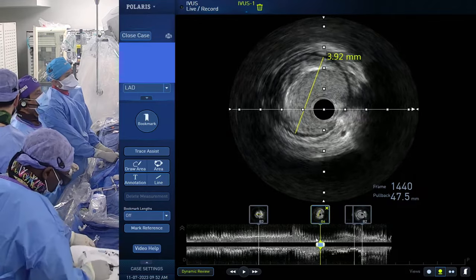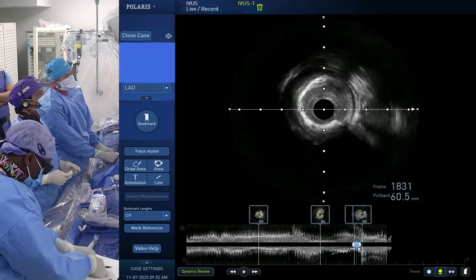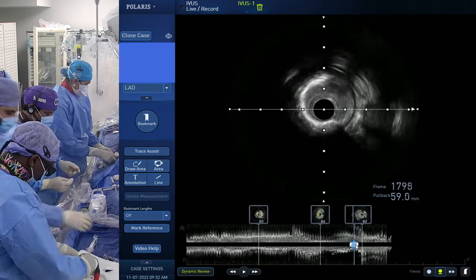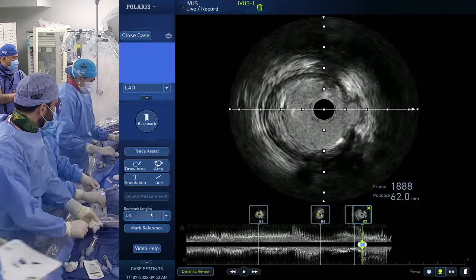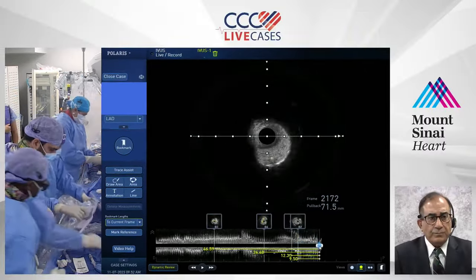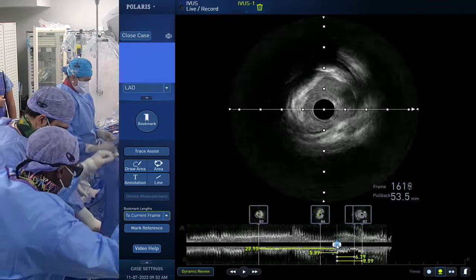Okay, 3.9 is the EEM to EEM, and a diffuse plaque. Go back. You have three quadrant calcium. Yeah, here, three quadrant calcium. This is the tightest and most severe calcium part. So this is exactly where the stents were getting held up. A little bit there. Trouble, yes. Leave it. Okay, so now we are prepared for that.